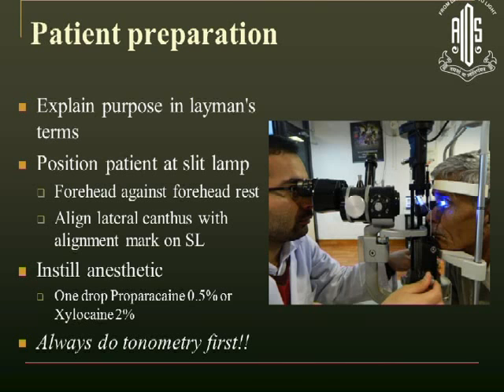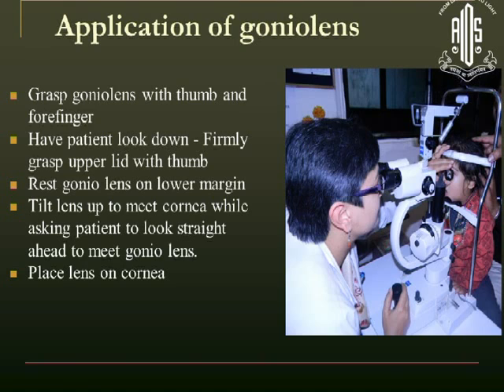This little girl is just 3 years old, and just to say that if you're really, really friends with your patient, anybody will let you gonioscope. She's an exception, of course, but it is possible. So when a resident comes and says, gonioscopy is not possible in this patient, I'm not really impressed with that. Because if you talk to them and you are gentle with your technique, most patients would cooperate.